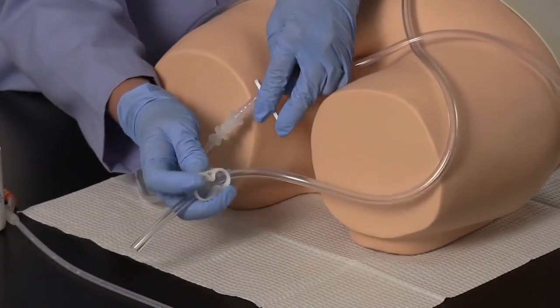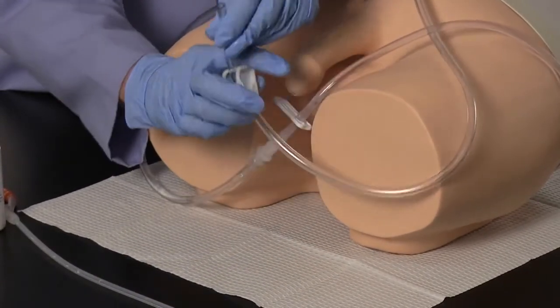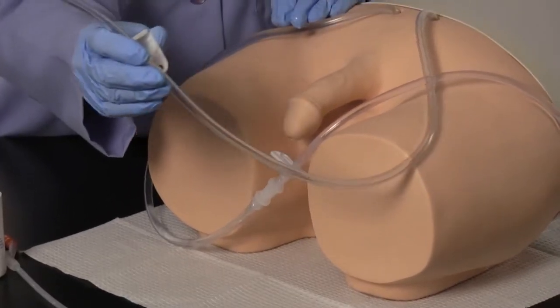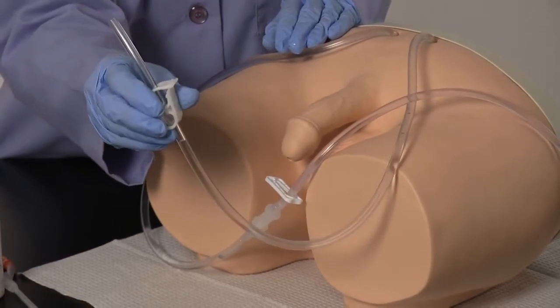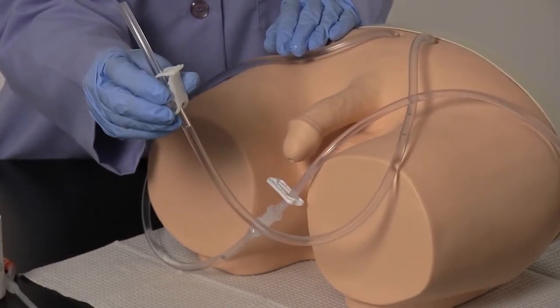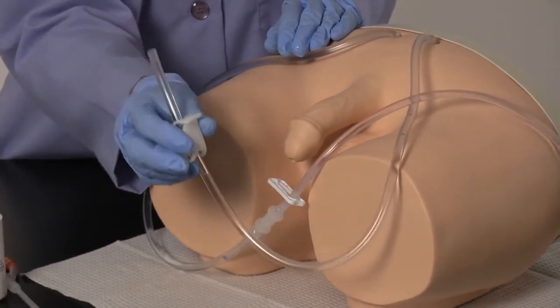To fill the simulated bladder inside, open both the slide clamp and the pinch clamp, allowing water to flow through charging the system, and then close the pinch clamp on the drain tube. Your simulator is now ready to perform catheterization procedures.